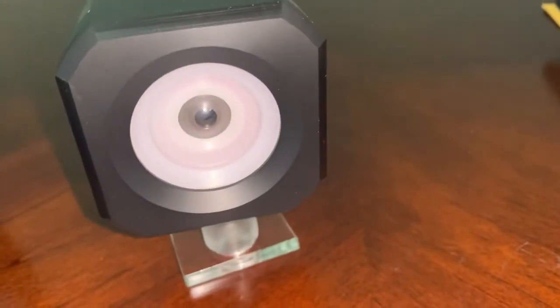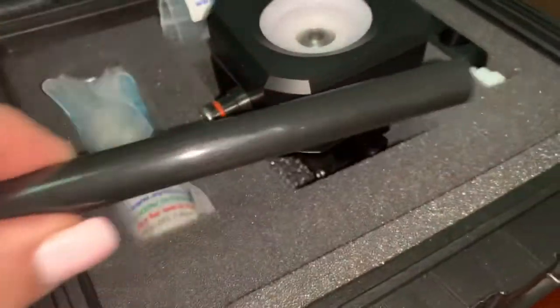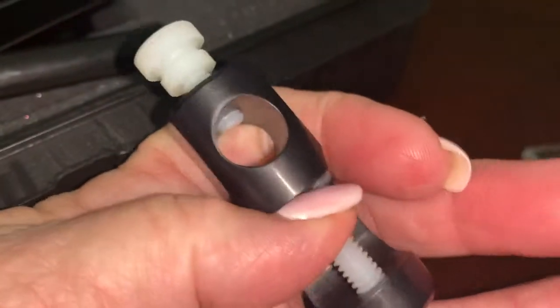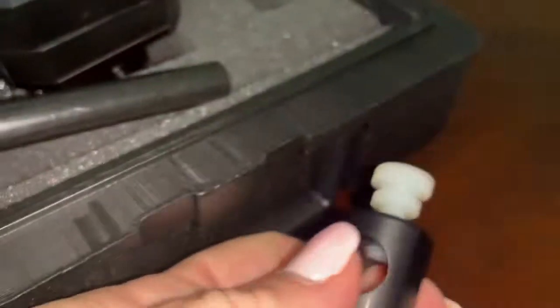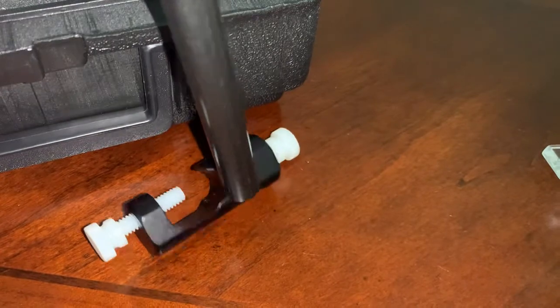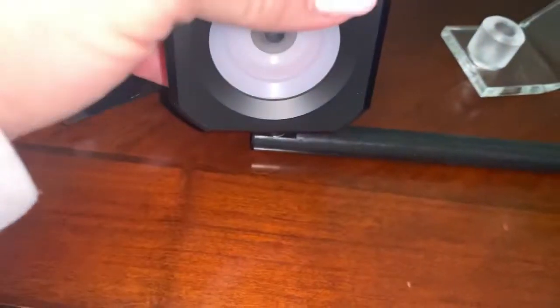The way that you actually mount this to the slit lamp is there's a bar here, and this bar attaches to the vertical bar between the chin rest and the forehead bar using this little clamp. This part is where the arm between the chin rest and the forehead bar — that vertical bar — goes. Then you've got this hole which holds this bar. This bar has a hole on one end, so you put that bar in there and then through that hole you place the tonometry model eye.